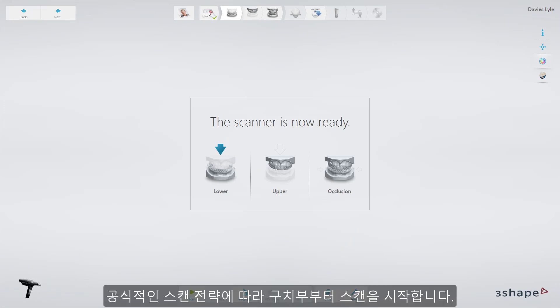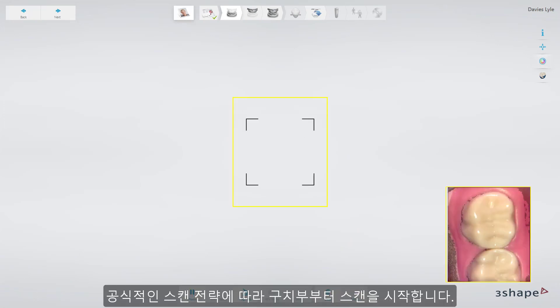Start your scan from the occlusal, on the most posterior tooth, following the official scan strategy.